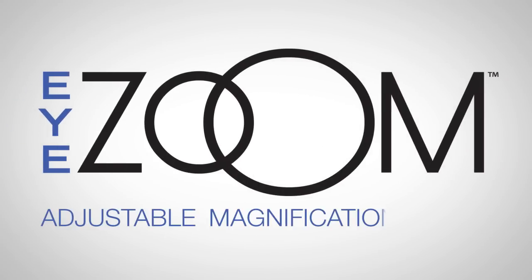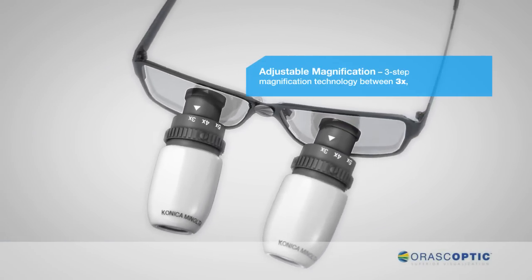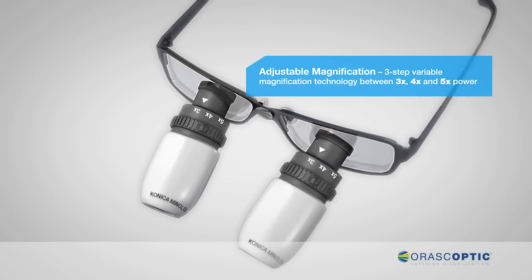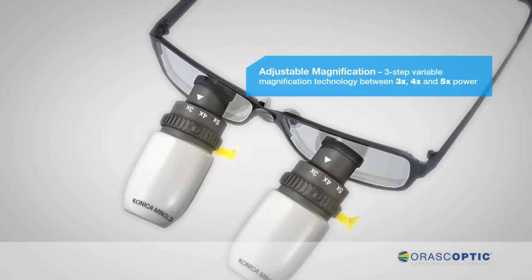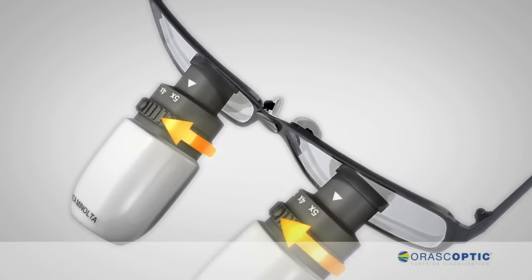iZoom. Adjustable magnification loupe. The iZoom employs a unique three-step variable magnification technology, allowing you to zoom in and out between three times, four times, and five times magnification power.